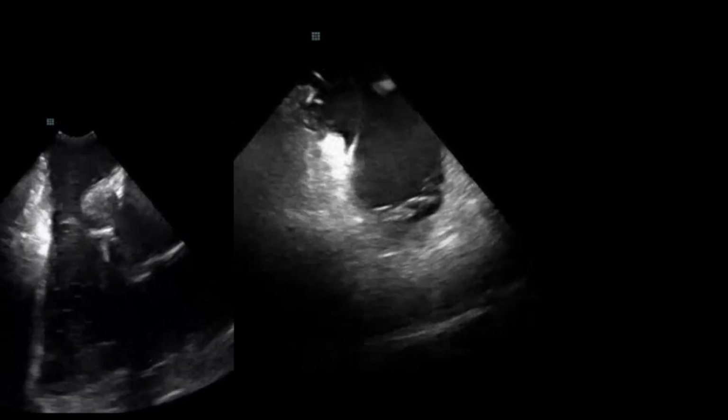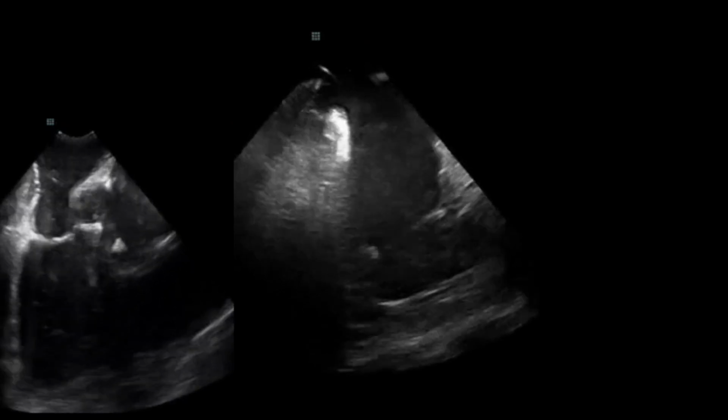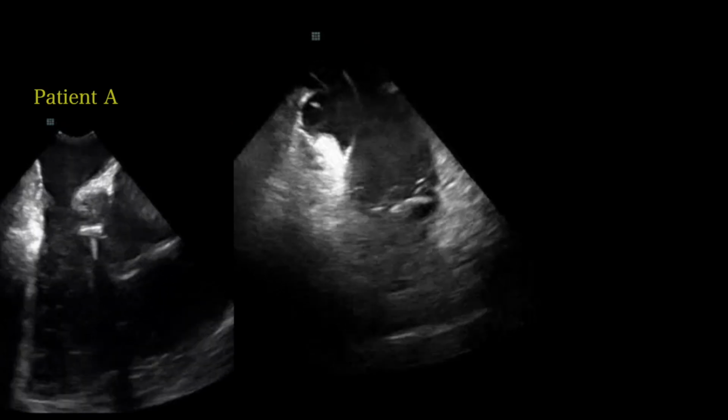Here is an example of a large pouch. Here you can see that pouch. If we pull back the ablation catheter and compare patient A, who has a very smooth CTI, to patient B, who has that pouch, the area I'm going to show now may have some leakage, because the ablation catheter may not touch that area and may go over it.